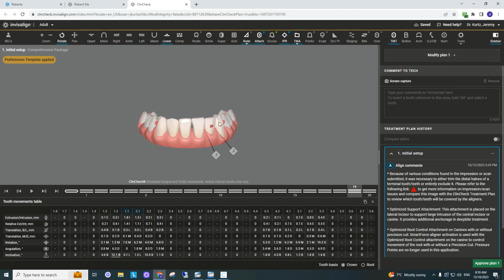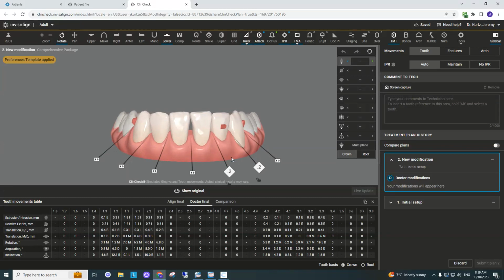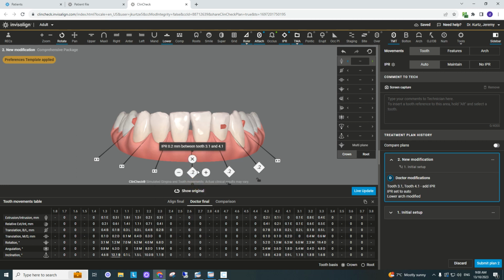So once I've gone through the Clincheck and sort of determined what I would need to do for you, and this one's not bad because this is already set with my presets, but a lot of times when I get Clinchecks back from other doctors, then I find that there's a lot of changes or more changes that would need to be made, especially in some of them that could be to the detriment of the patient if it's not planned correctly. So I clicked on modify, as you saw before, and so here I'm going to do some of the changes myself. So I don't like the black triangle here, so we're going to add some IPR.